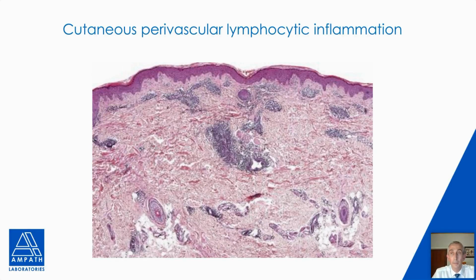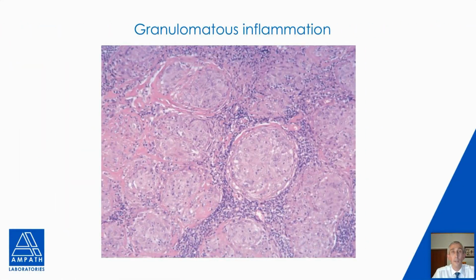And granulomatous inflammation. This is a lymph node biopsy. One can appreciate well-formed epithelioid granulomas. This can be seen in cases of infection, whether it be tuberculosis, fungal infection, leprosy, brucellosis. It can be seen in sarcoidosis. It can be seen in foreign body cases, foreign body granulomas. So if our special stains do not highlight an infection, we are compelled to ask the clinician to kindly correlate clinically, could this not be infection or sarcoidosis?